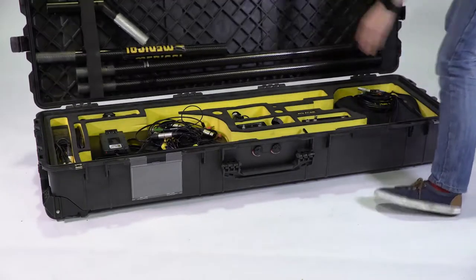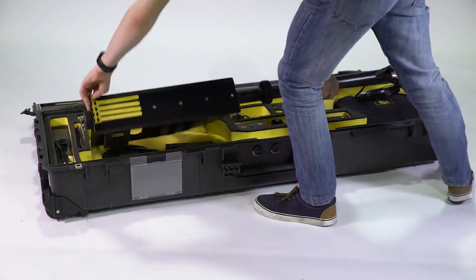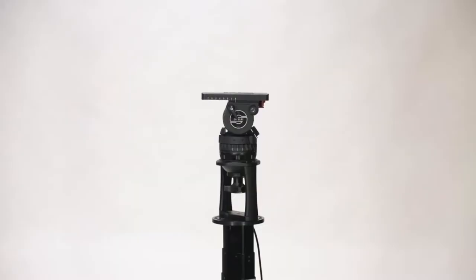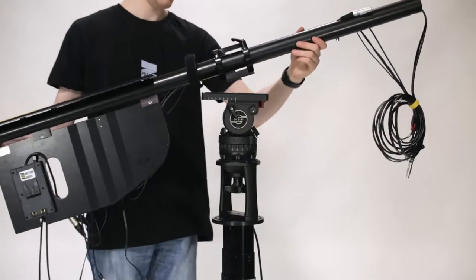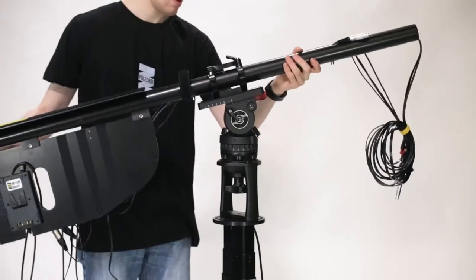Now open the main box. Remove the back and carefully mount it to the head. When you do this, ensure the levelling bubble is at the front so it can easily be seen. Ensure the paddle is vertical and lock it into place.